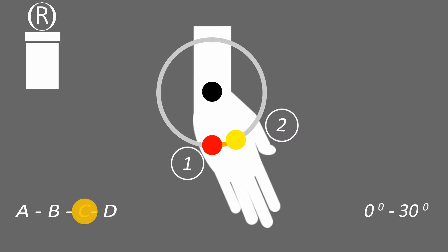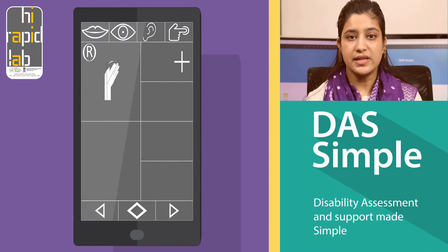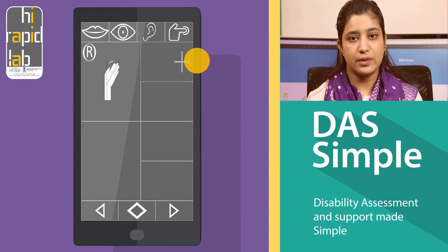The red dot should be positioned parallel to the third metacarpal, and slide the yellow dot parallel to the third metacarpal. The angle will be automatically displayed, and when you click save or next it will be automatically captured in the database. The next test screen then opens.